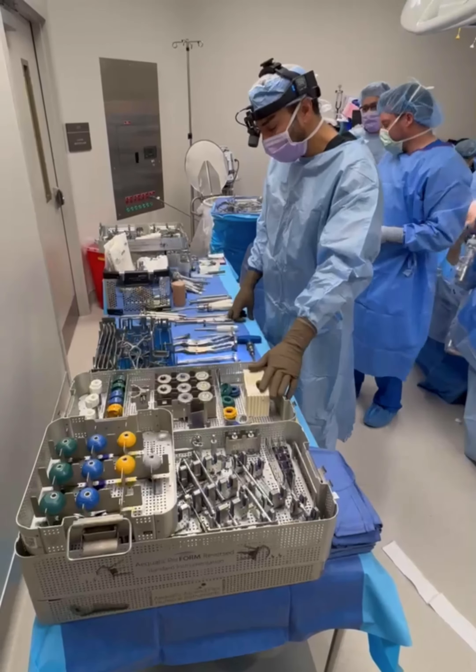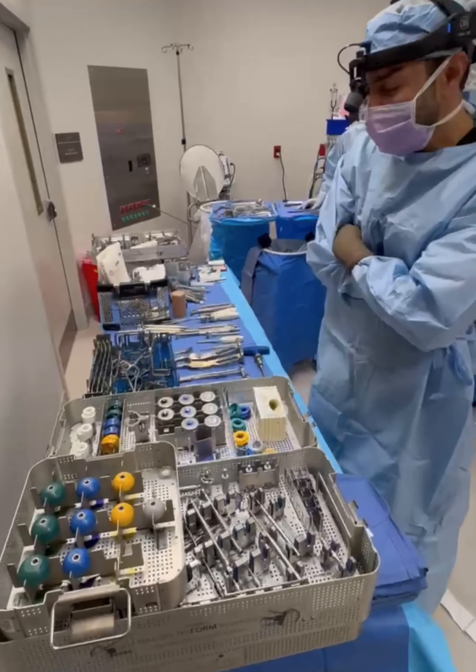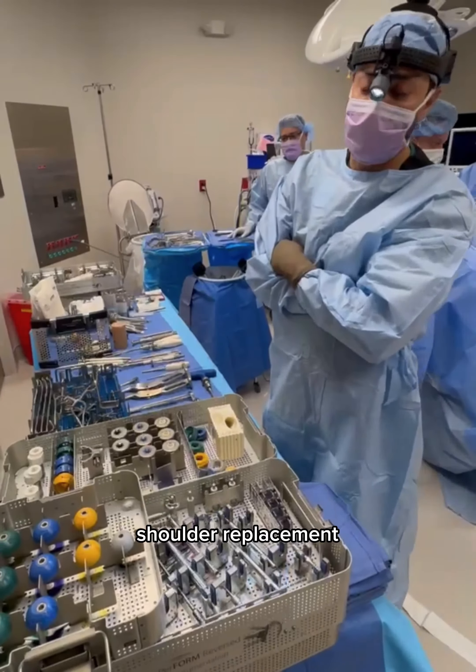Okay, good morning. One thing I wanted to do today — I think could be interesting — is to see what is going on behind the scenes whenever we're doing something like shoulder replacement.